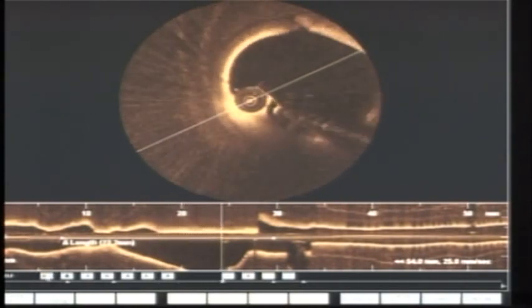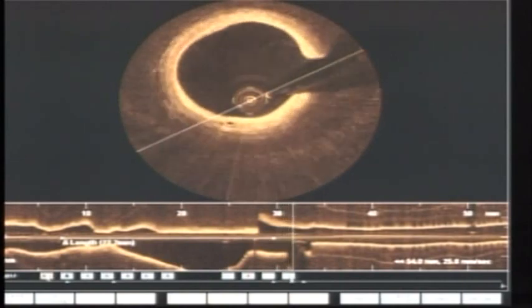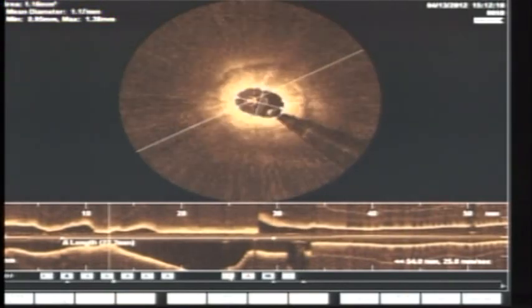And then just before the emergence of that marginal branch, we also have an area of 2.8, if I'm not mistaken. Is that correct, Daniel? Yeah, 2.8. Mark is going to tell us what we have to see here, and if you want to discuss the FFR case.